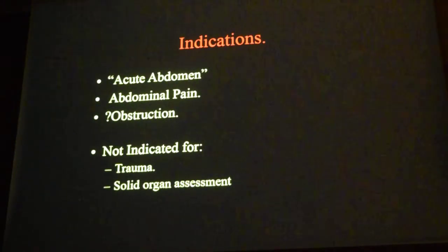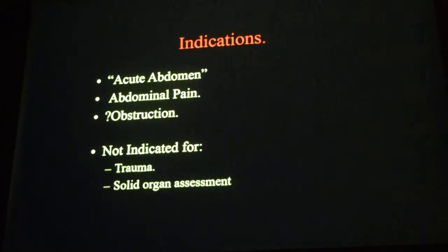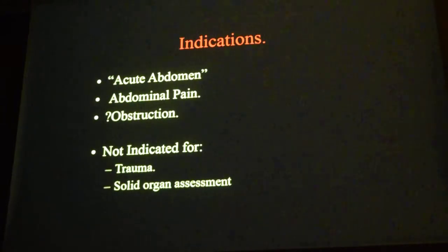In such cases, what would you do? Ultrasound. CT scan or ultrasound, which is fast ultrasound. You do a fast ultrasound, which is a quick ultrasound, just to look for free fluid in the peritoneal cavity. So if you see free fluid in a normal person after trauma, that means there is some injury to some organs. Either a viscera is injured or there is injury to some vessel which is bleeding inside.